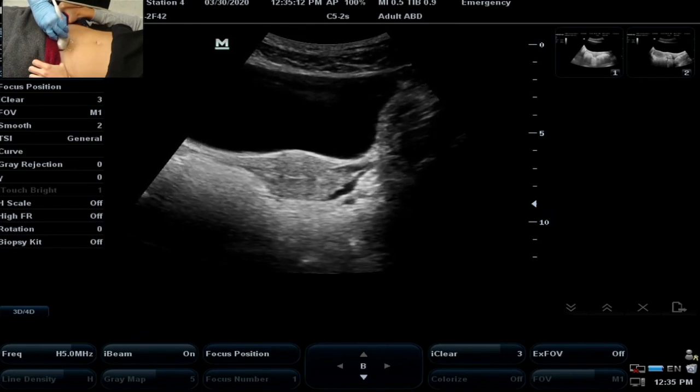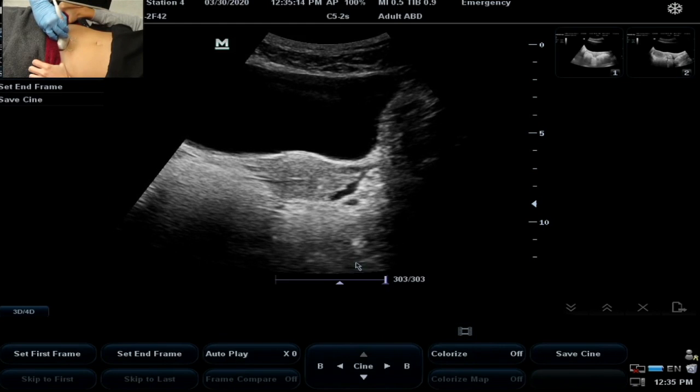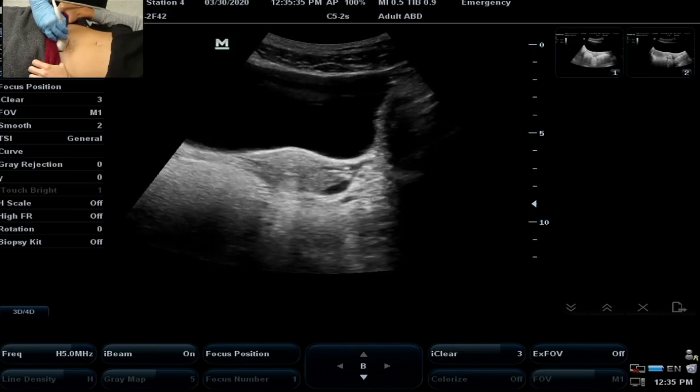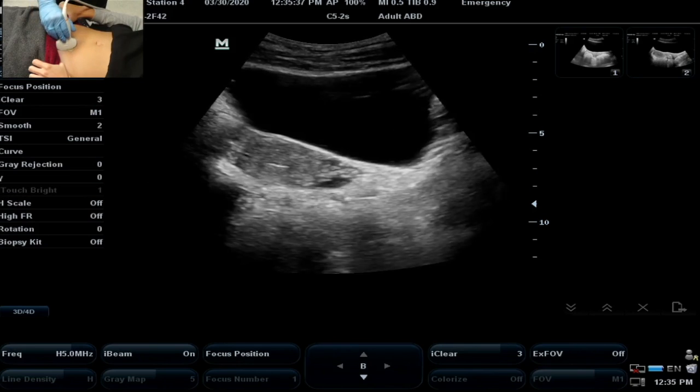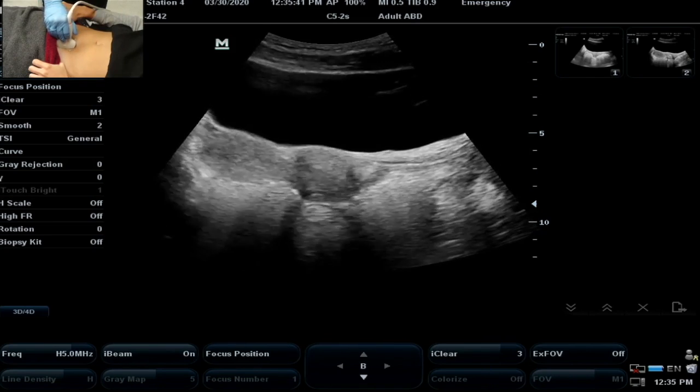Now, be aware that in the female, you may find trace amounts of fluid when you're scanning through. And I'll put my arrow right here, which is normal to find in a female related to her cycle. But this is the value of sweeping through, because this was not deep in the posterior cul-de-sac, but I was able to scan through and find it right here. But it's only a small amount.